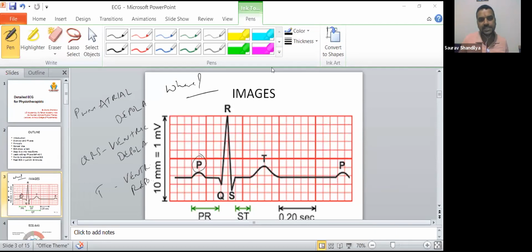Right? So now just see the relationship of atrial and ventricular contraction with the ECG waves, how it goes. Before contraction happens, depolarization has to spread across the muscle to initiate the atrial contraction, right? So P wave occurs just before the atrial contraction. That's what you are seeing, the P wave. Then it causes the atrial contraction. And then the QRS wave, of course, occurs just before the ventricular contraction. After that, the ventricles remain contracted for a few more milliseconds after repolarization occurs. That is what you find as the T wave, because it is ventricular repolarization.